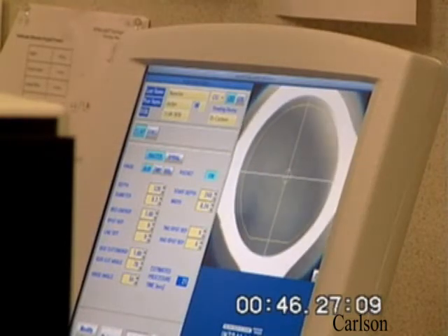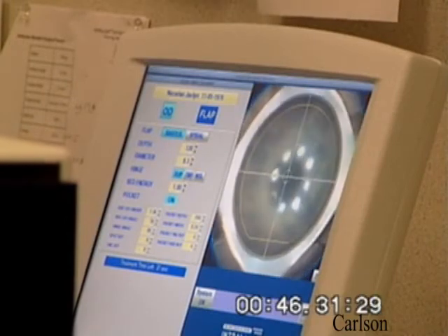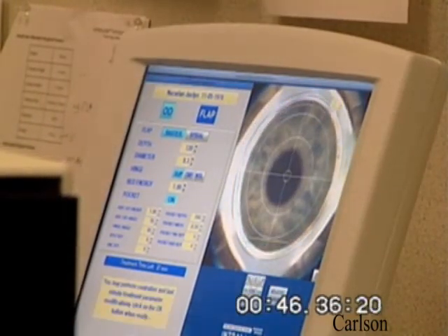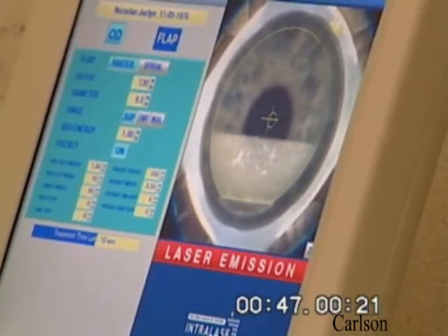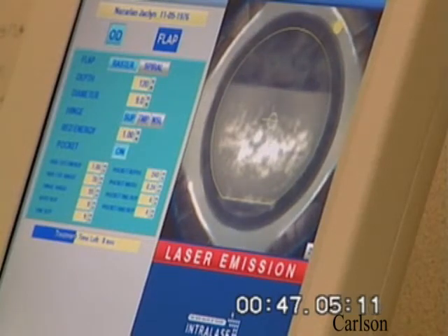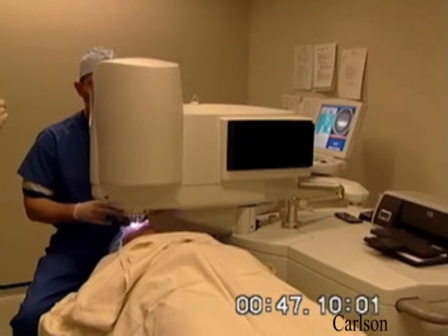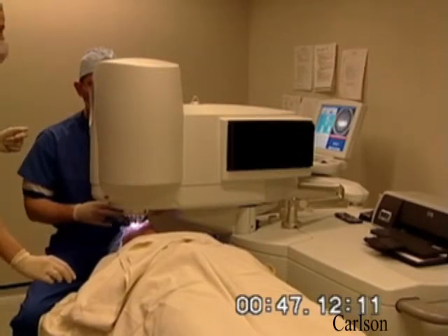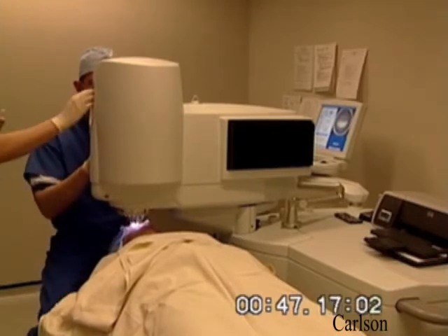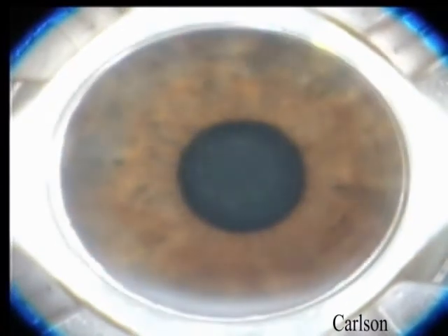The new 60 kilohertz femtosecond laser makes LASIK at Duke a completely blade-free operation. Patients are given a topical anesthetic drop as well as a sedative to control any anxiety that they may experience. Patients commonly report feeling some pressure around the eye at this point in the procedure. We purposefully keep our laser rooms very cold, and that's why we give the patient a blanket.